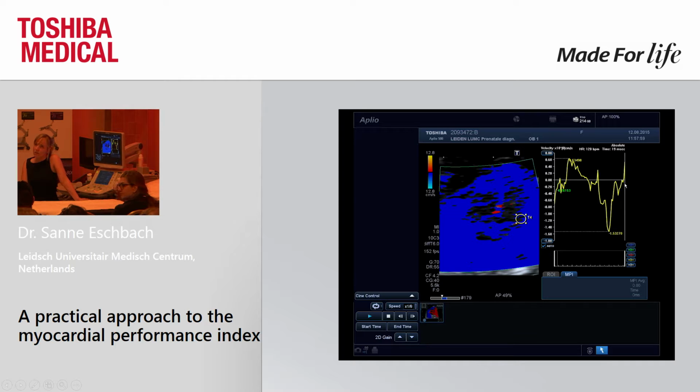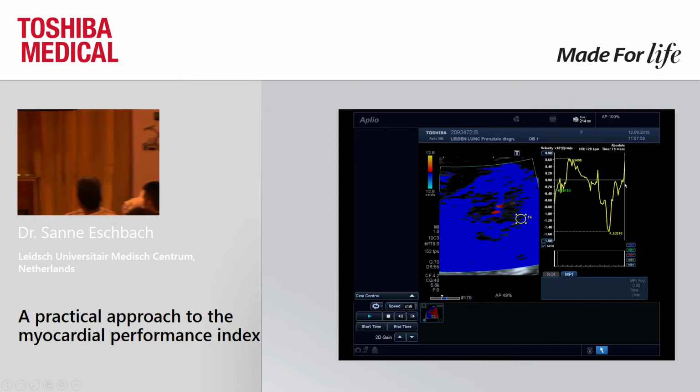If there are, yes? The main action comes from the right heart in the fetus, but for HLH, you can also make a prediction, I guess, with this step, potentially, or not? For the left side. Yeah, exactly. Plus the linker. I think when you, because then the left side, the feasibility was about 75%, so it's quite high. So yeah, I think it will work in these cases as well. I didn't try it yet because I'm more focused on TTTS.